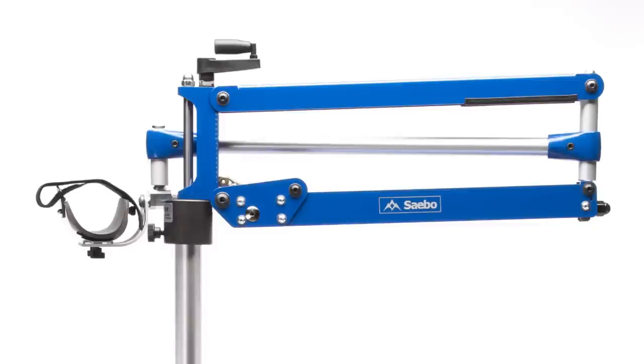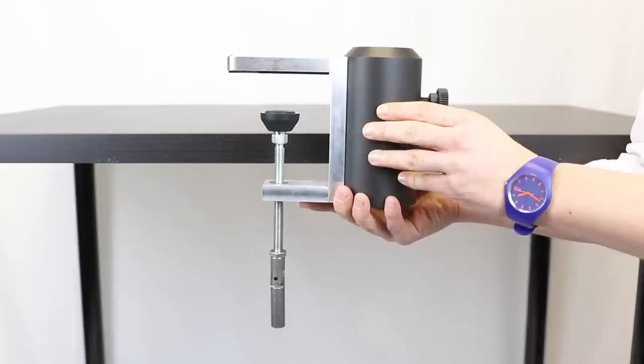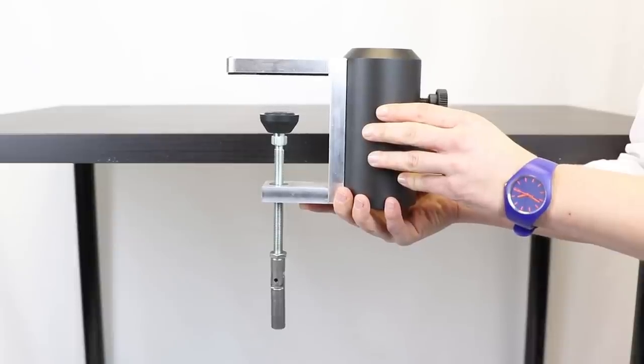During this tutorial I will be demonstrating how to set up and use the Sabo mobile arm support. Firstly I'm going to show you the table mount option and how to attach it.